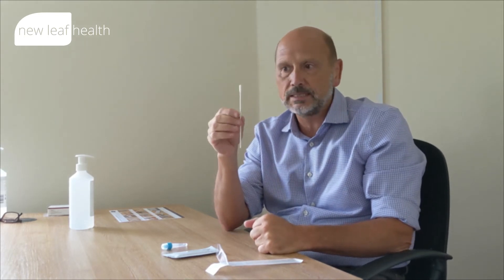Two centimetres in, and we roll that swab around the nostril four or five times. Extract and remove it to the other nostril — four or five times around. Notice we're not going deep into the cavity, which makes the eyes water, or deep into the posterior nasopharynx, which is very uncomfortable and needs a professional to do that test.